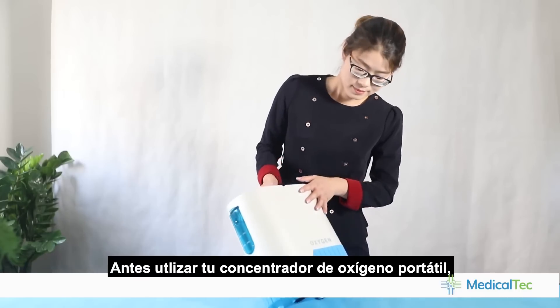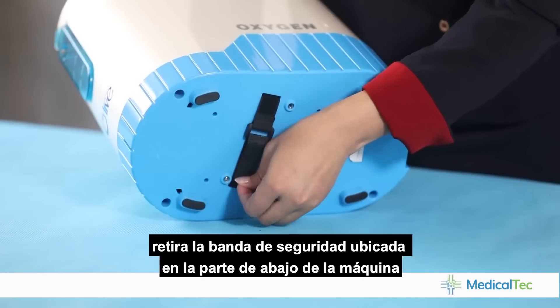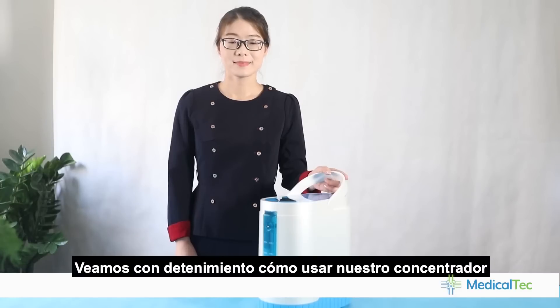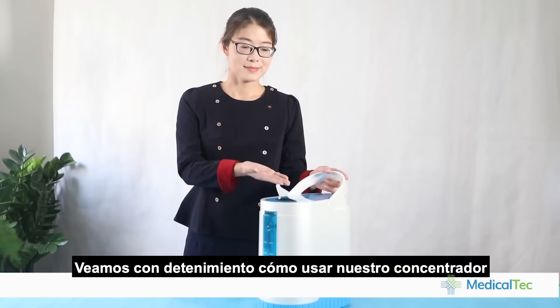Before you use the portable oxygen concentrator, please remove the fixed belt on the bottom of the machine. Now, let's take a closer look at the oxygen concentrator.